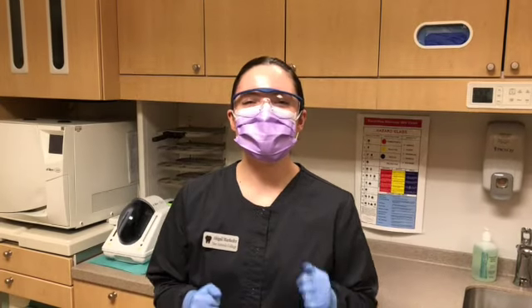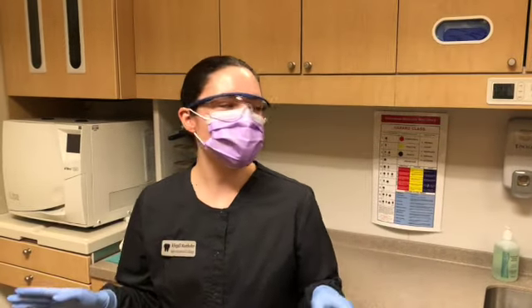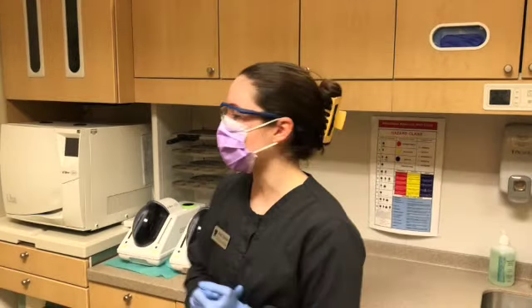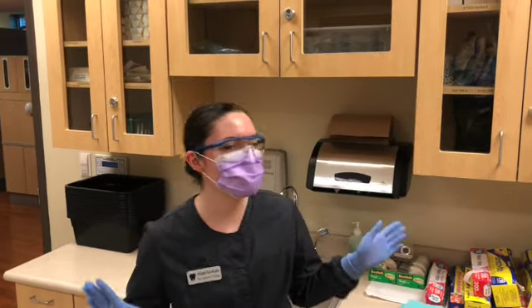And the next step is to turn on any sterilizing equipment and check solution levels, as well as preparing new ultrasonic and disinfectant solutions, as well as completing any overnight sterilization procedures. The last step for opening the dental office is to replenish any supplies needed for the day.